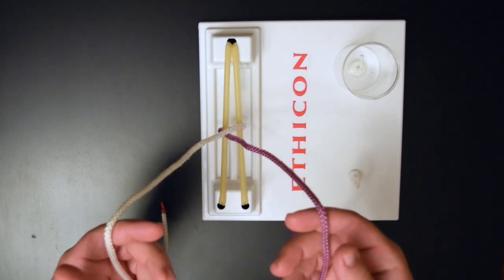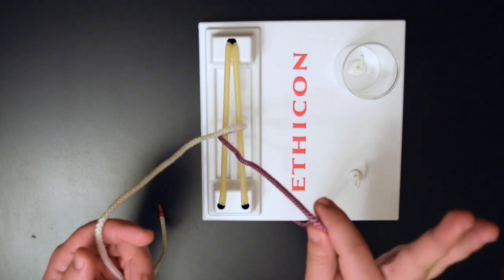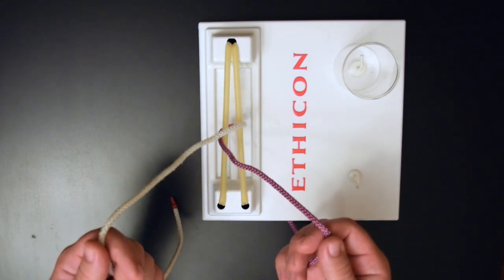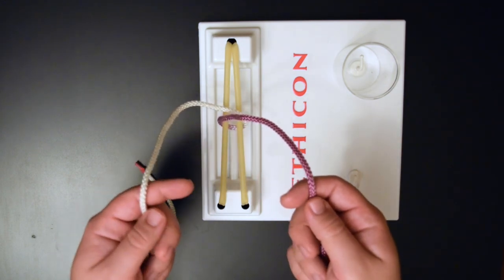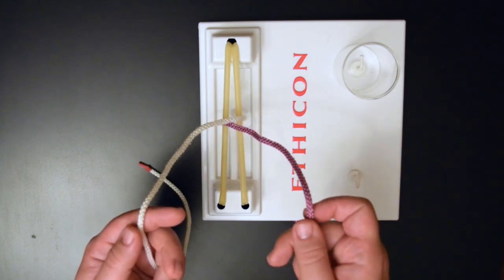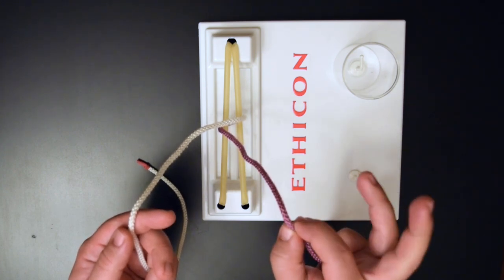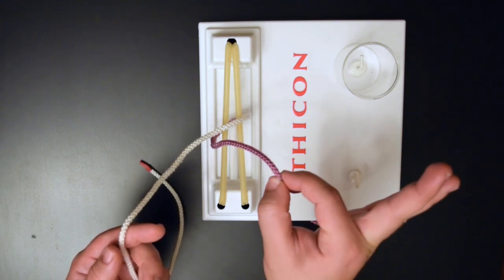With the one-handed tie, most of the work is going to be done with your right hand, and your left hand really just holds the suture for you. With the one-handed knot you're going to have two throws. For one of them, you're going to pinch your suture between your index finger and your thumb and form an OK sign.